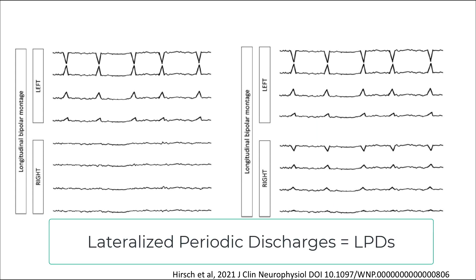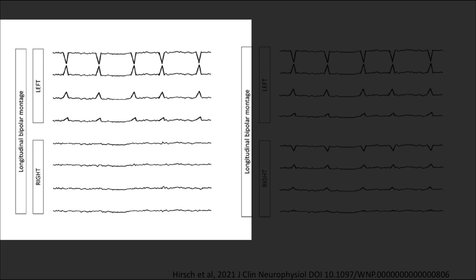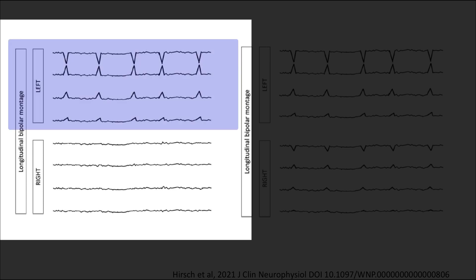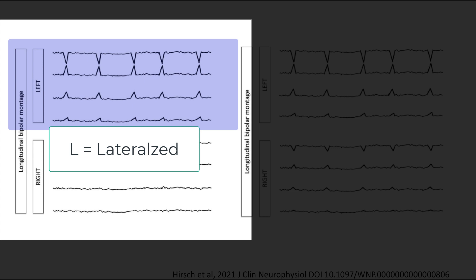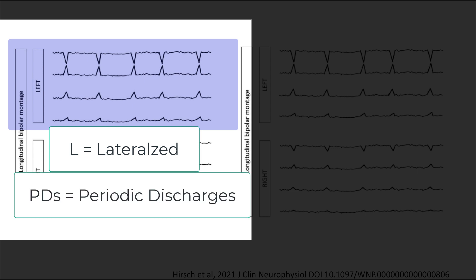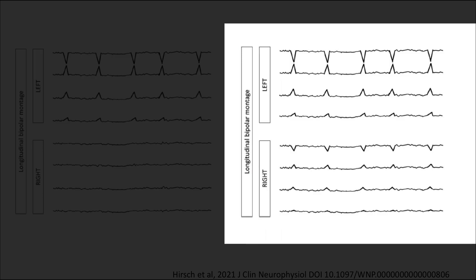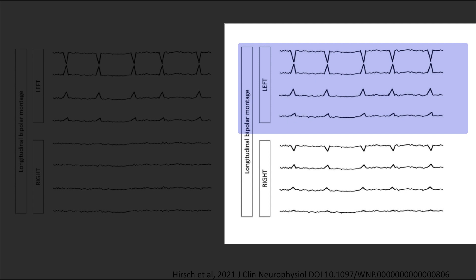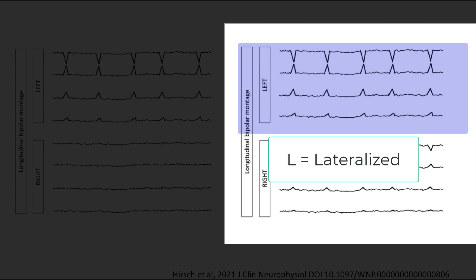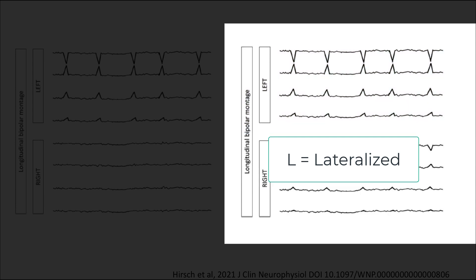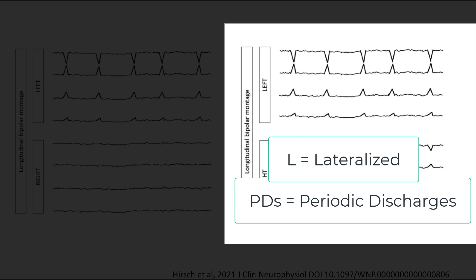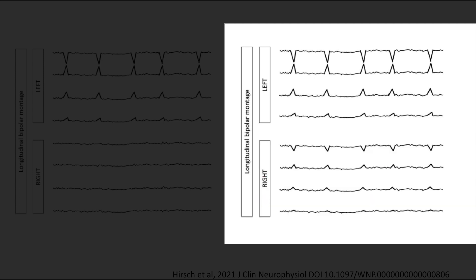These are both examples of lateralized periodic discharges. In the first example, discharges are exclusively present in the left hemisphere with a clear inter-discharge interval — we call these LPDs. In the other example, discharges are present in both hemispheres but clearly much higher voltage in the left. When a pattern is much more prominent in one hemisphere, we call it lateralized and add the descriptor bilaterally asymmetric, giving us LPDs bilaterally asymmetric.